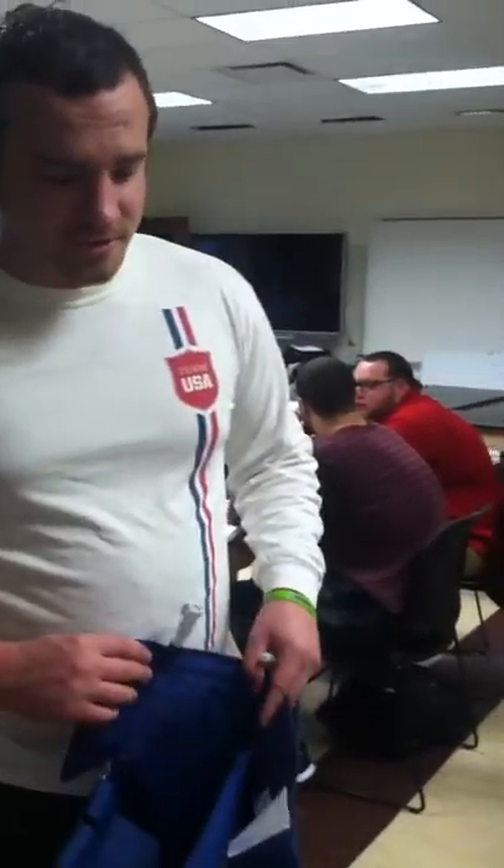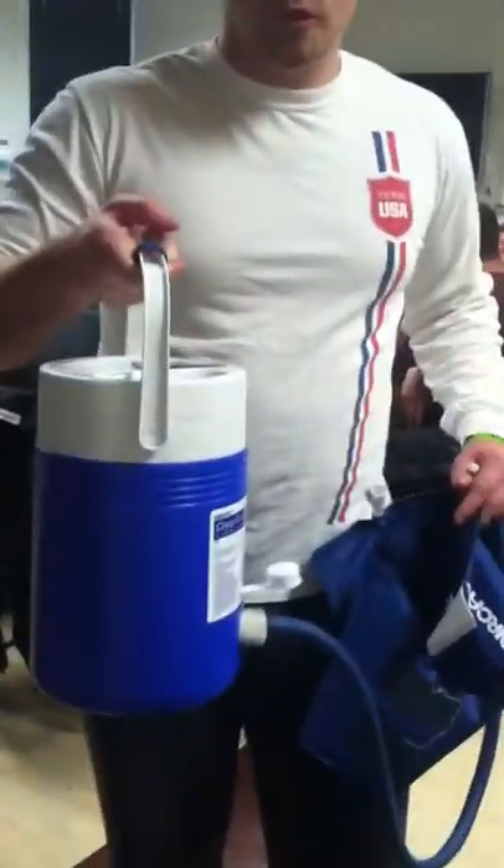Today we're going to do a cryo cuff for an ankle sprain. First, you fill the container with ice and water, then shake it up.